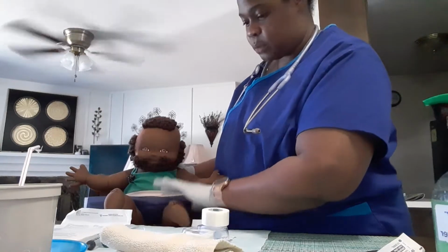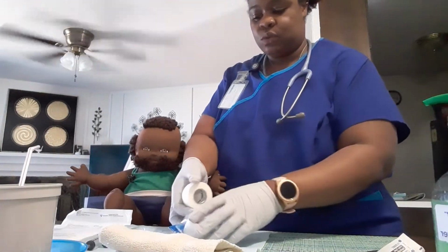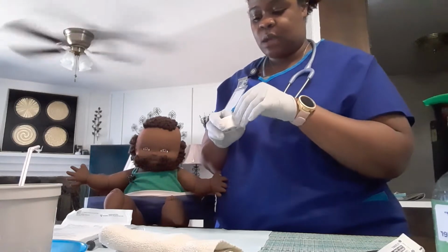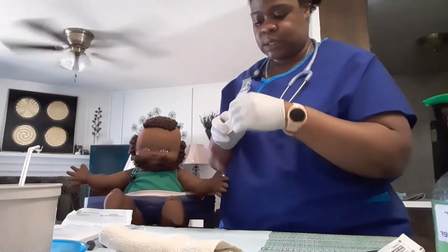You doing okay, Mr. Chamberlain? He says yes. I am going to open my tape, and I'm going to tear off two pieces of tape. One tape is going to be just a regular piece of tape.